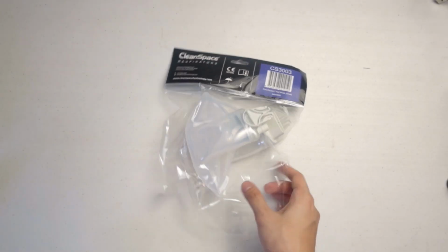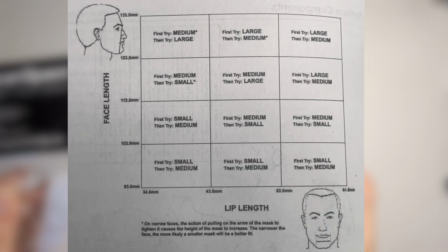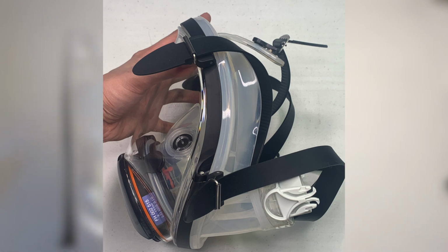Now this is the half-face mask that comes in different sizes, small, medium, and large. I do suggest that you get yourself fitted before purchasing or choosing a mask. These are the specific measurements indicated in the manual for your reference. Also, do keep in mind that there is an option for a full-faced mask.